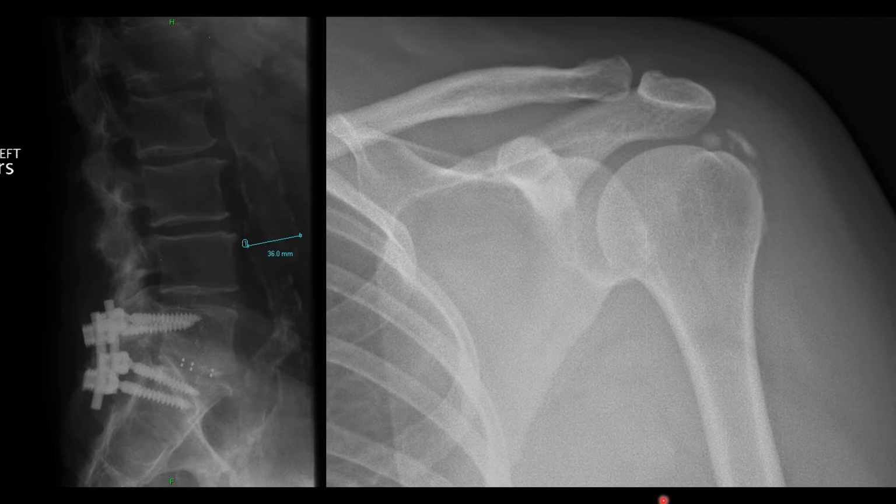Something else to look for within the soft tissues would be any kind of deformity. For example, if this shoulder was dislocated, you could see possibly evidence of a sulcus sign where the skin bows in, or if there's a fracture here at the acromion or at the greater tuberosity, you could have this broken off and then there'd be swelling around it and there would be differences or fullness within the soft tissues around it.